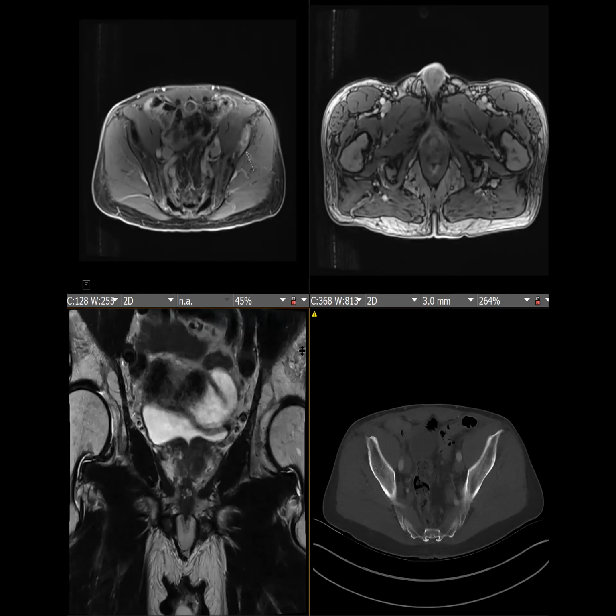Nice. Yeah, that's cool. And then I have one other thing that I'm curious what the group thinks about. My MSK colleague, I always tell people, if it has fat in it, that can't be a MET. My MSK colleague recently told me that early METs can have fat in them because the metastatic cells can interdigitate with the fatty marrow. Oh, wow. That's really good to know. I know, but he really messed me up because I was using this as a rule, if it has fat, I can just write it off, but apparently not. But this was a very interesting case, and I just wanted to share that with the group.